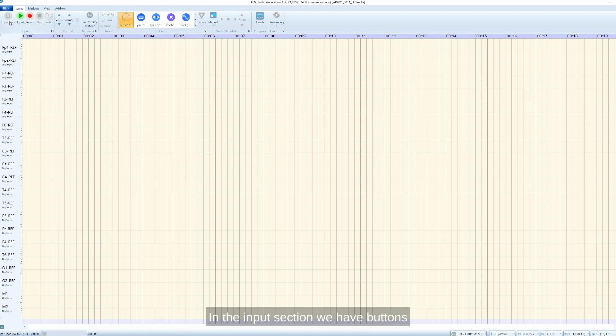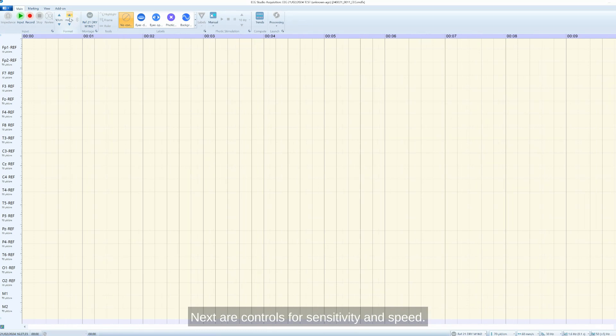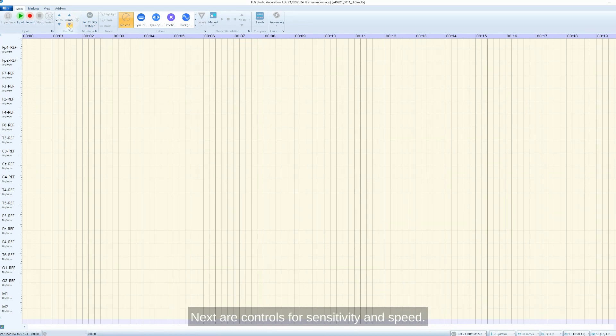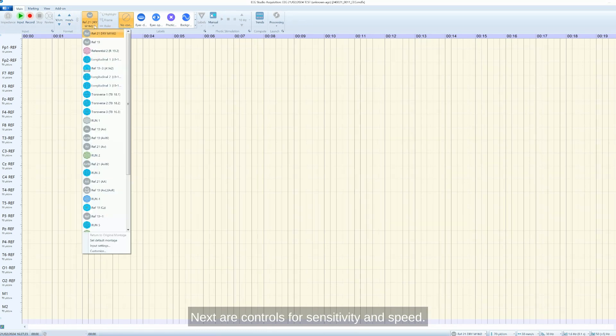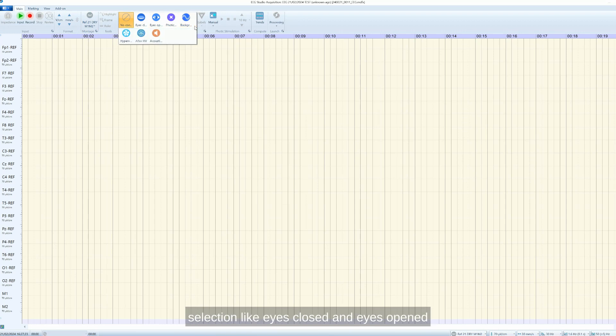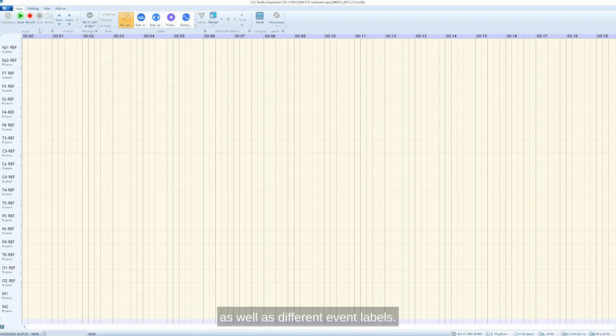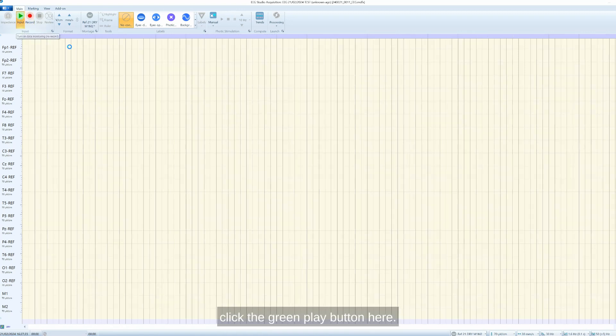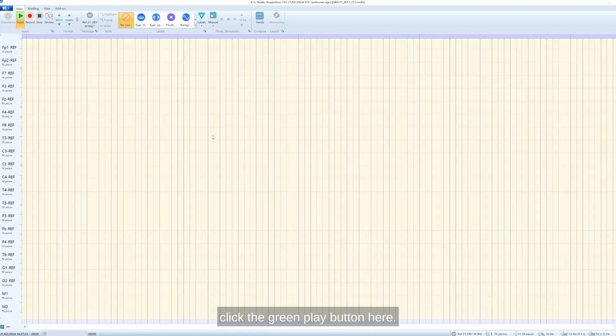In the input section, we have buttons to control recording and start impedance window. Next are controls for sensitivity and speed. Then comes montage list and recording condition selection like eyes closed and eyes opened, as well as different event labels. To start data input, we simply click the green play button here.